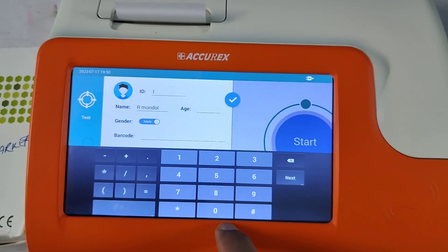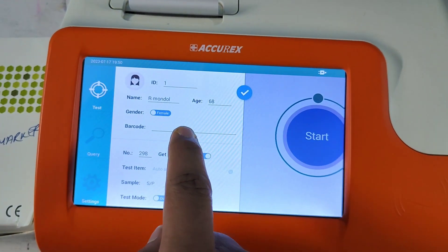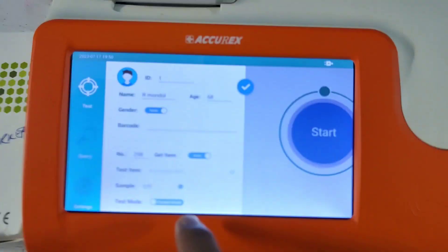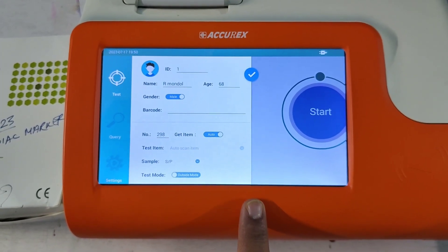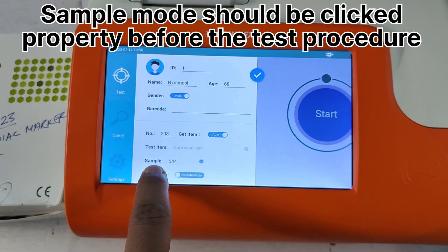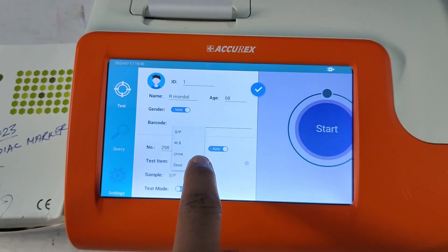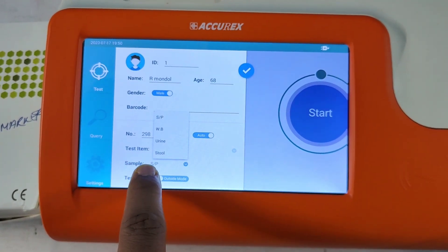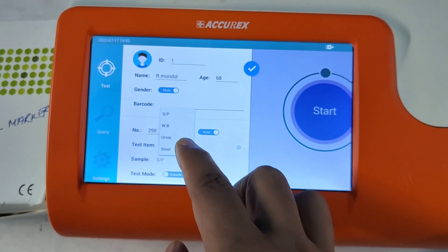Make sure the age is set to 68, and for gender you can use this point to change between male or female. I am not going to enter a barcode. In this method, look at the sample mode — sample mode can be either serum or plasma, whole blood, urine, or stool.